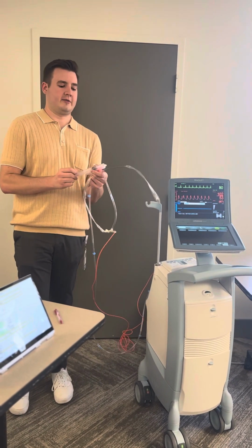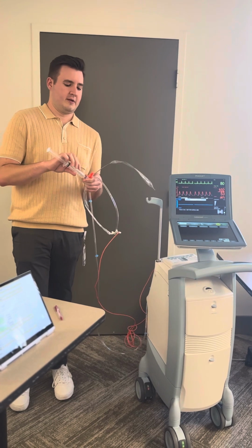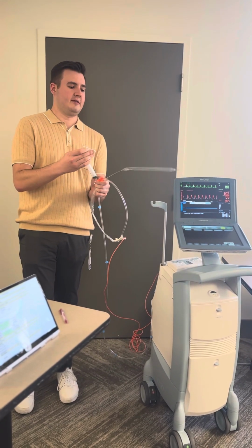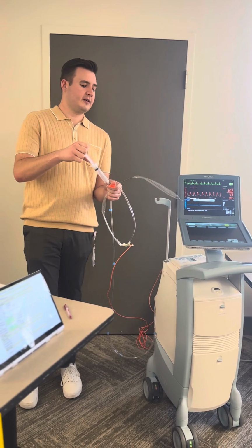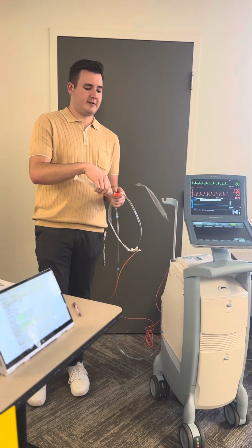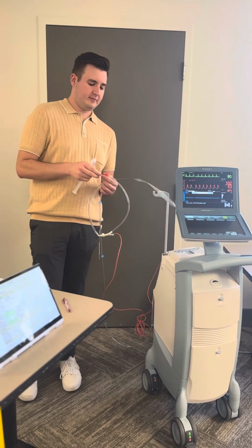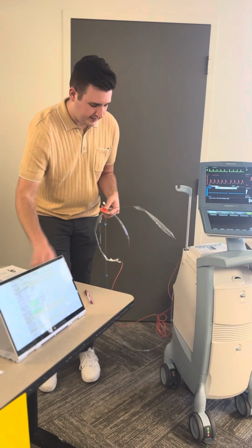You're going to draw back to 40 mils. And every 3 to 5 minutes, all you're going to do is inflate it and then deflate it. It's not going to inflate as much as it does when the machine does it, but I think that's just to keep clots from forming on it. But go ahead and hook it back up.